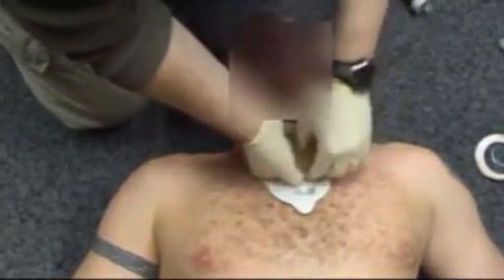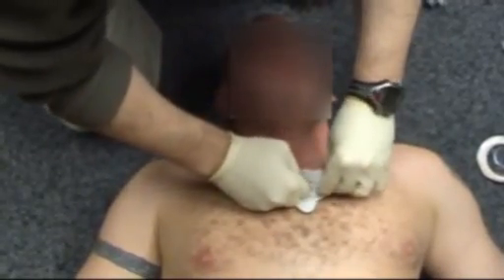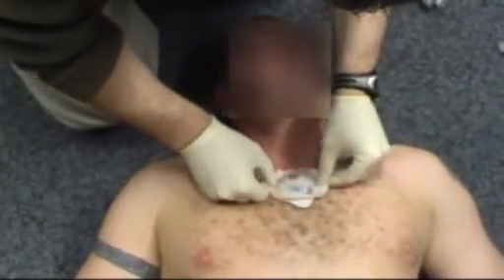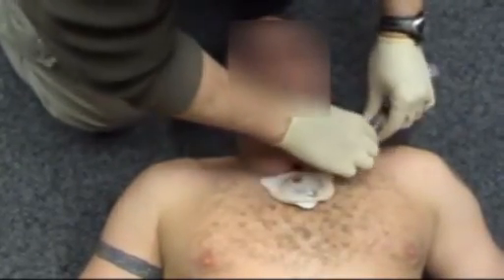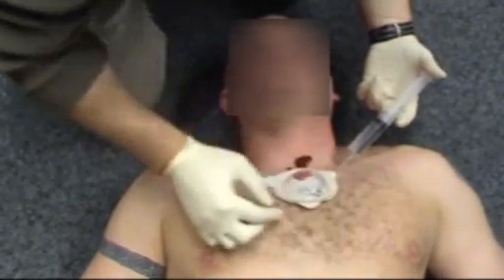And then that's it. Nice. Connect it there. Get the rod going up. Connect up the dome. You'll always get a little bit of trickling. Make sure that this goes in there. This may be a little bit painful. Nice. Okay, and that's it.